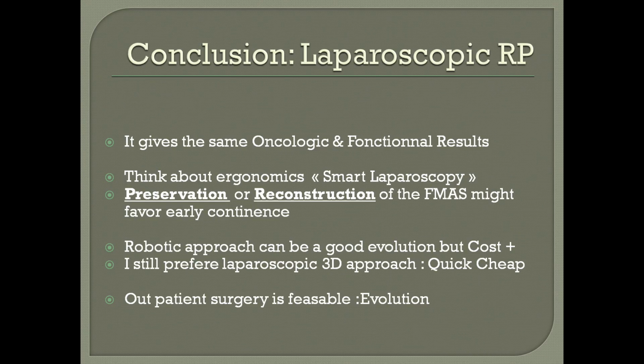But I'm doing a smart laparoscopy. That means a modern laparoscopy with a good ergonomic system, with a good 3D vision, and I think it remains fantastic. Go on with this surgery, and thank you for your attention.